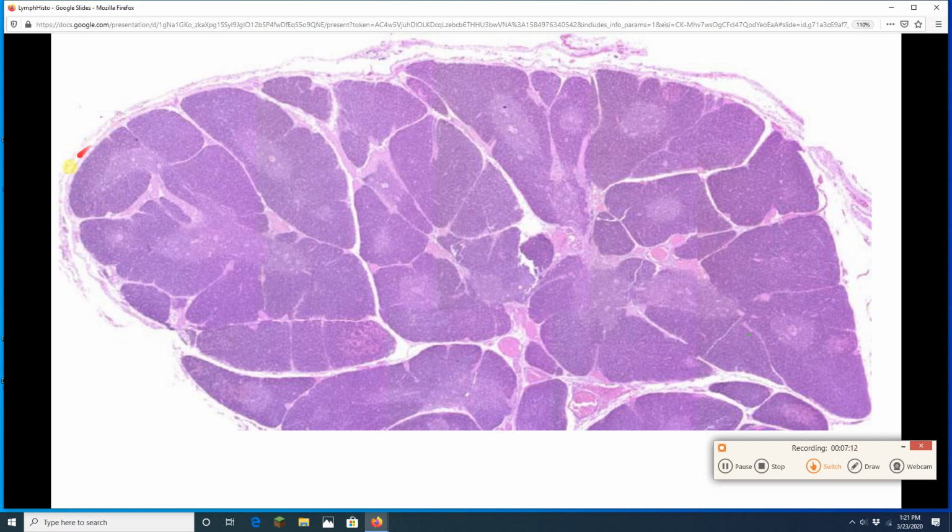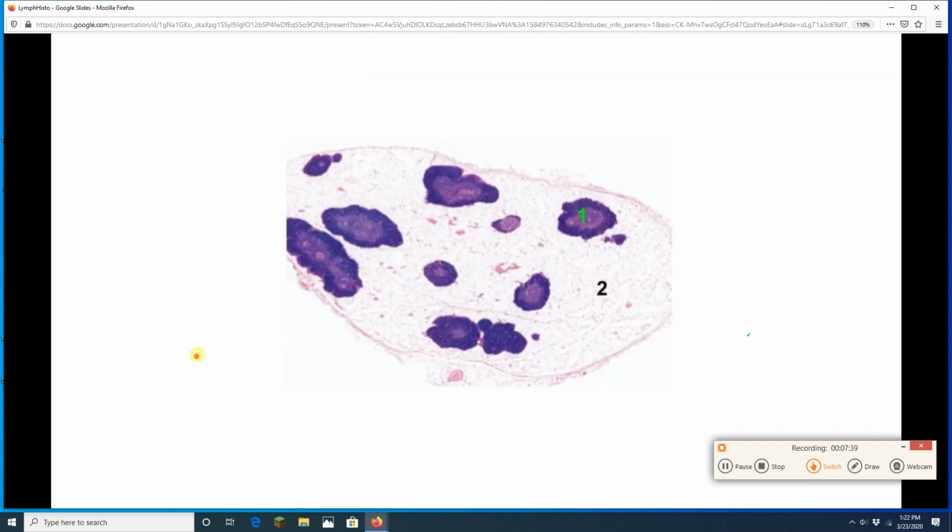There is a connective tissue capsule around the outside, plus I've got connective tissue septa, kind of like trabeculae, but they're called septa here, chunking the thymus up into lobules. So, big beautiful thymus like this, we find in the infant or the fetus because we got to get that immune system trained early. We can contrast that with the adult thymus.